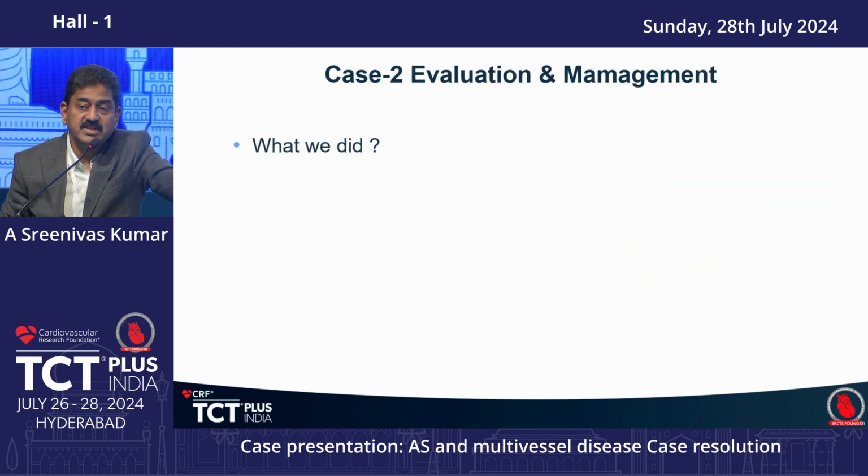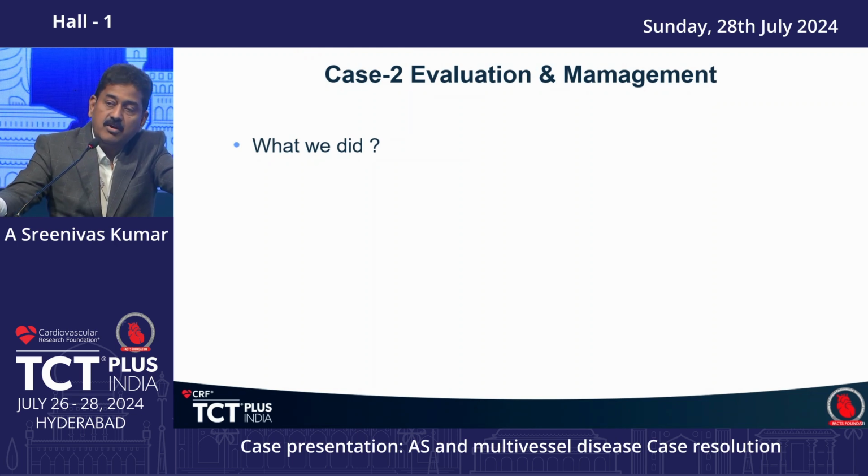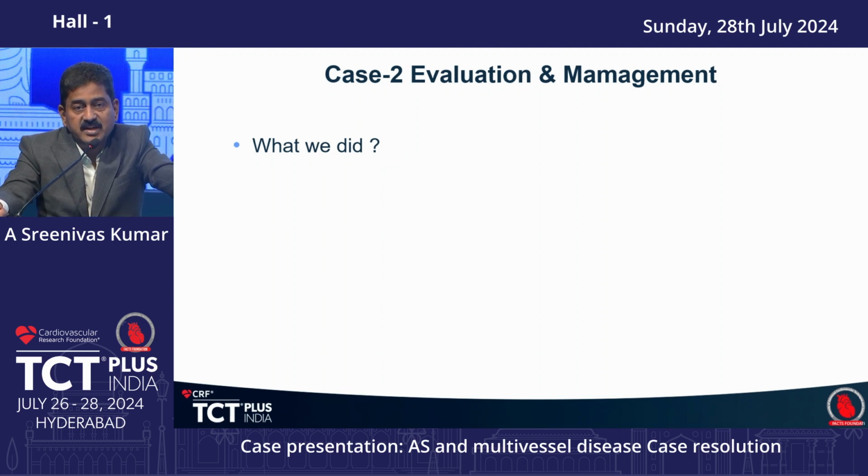So in other words, if the patient has critical ischemia as presentation, we tackle that first. Some could argue that CABG plus AVR could be done, but the patient was requesting. That's why we tackled it this way. But if we are doing such complex DK crush procedures, take help of imaging, do the job right, otherwise it is likely to come back. Fortunately, at 2 years he is doing all right.